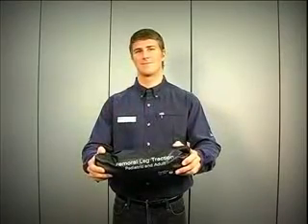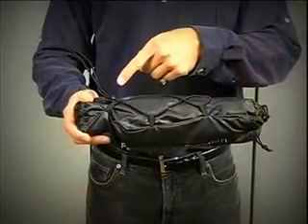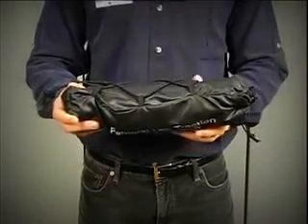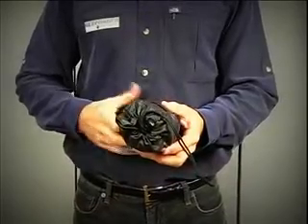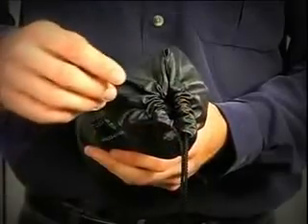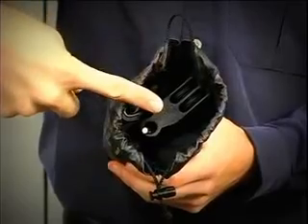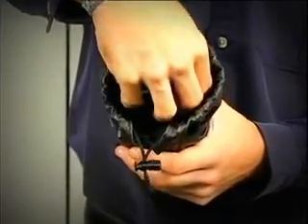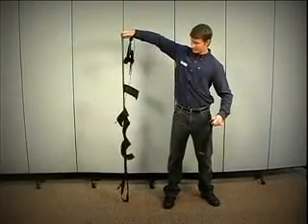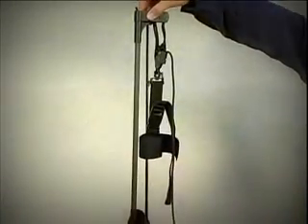Deployment is very easy and straightforward. The unit comes in a small cinch bag with cinch straps. Release both of these by squeezing the buckles. Reach into the bag, grab the plastic end piece, and pull it out of the bag. Hold the unit at shoulder height allowing the tubes to hang and intersect. Attach those that don't and straighten any necessary straps.